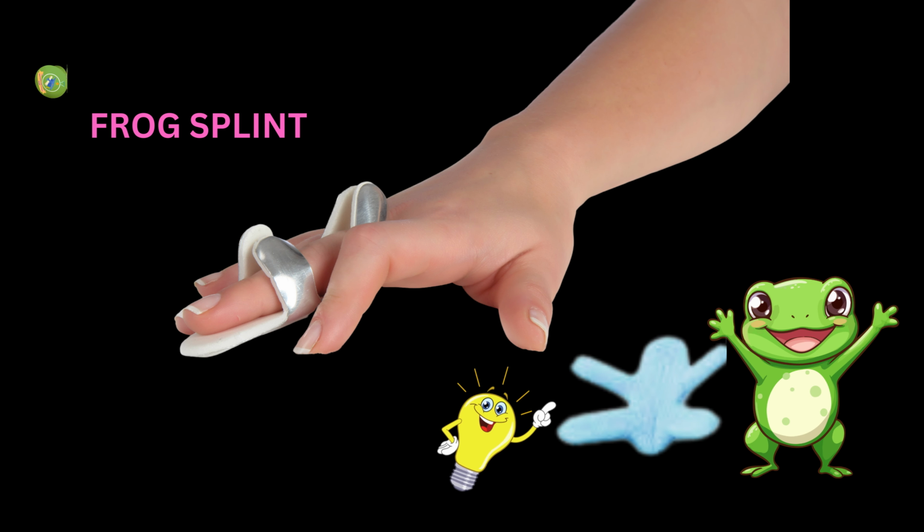This is called a frog splint. This static splint made of a malleable aluminum is sometimes used in the non-operative management of phalangeal fractures or minor finger sprains.